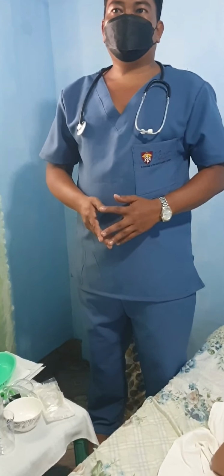Today I'm going to perform the NGT tubing. NGT tubing is a tube that is inserted through the nose, down the throat and the esophagus, and into the stomach. It can be used to give drugs, liquid and liquid food, or used to remove substances from the stomach.